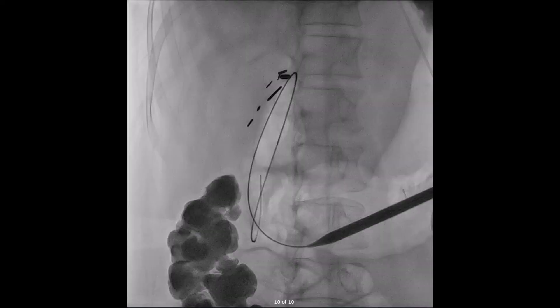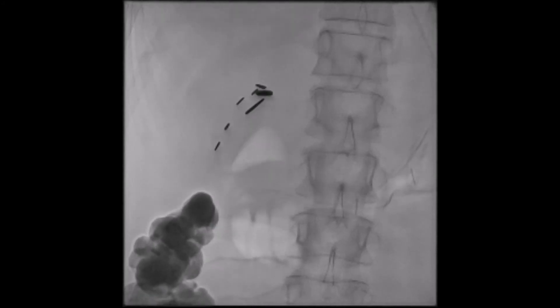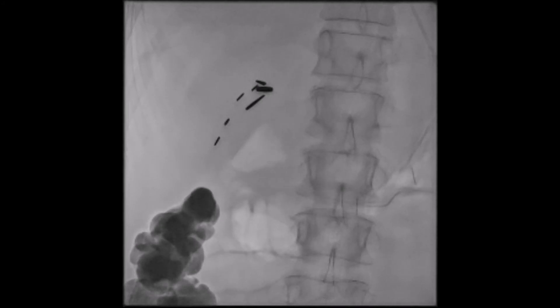Here's a picture of my wire and sheath — or possibly the dilator, I don't remember. Ideally, you'd like to see the wire contact three walls of the gastric lumen. This adds one more layer of certainty that you're in the correct position before you begin to serially dilate the tract and place the peel-away sheath. Honestly, I would have liked a bit more wire purchase on this case. Here is a slow-motion clip of me pulling back the gastrostomy tube after placing it through the peel-away, removing the sheath, and inflating the balloon with sterile water. The peel-away was 20 French, which easily accommodates a 16 French gastrostomy tube.